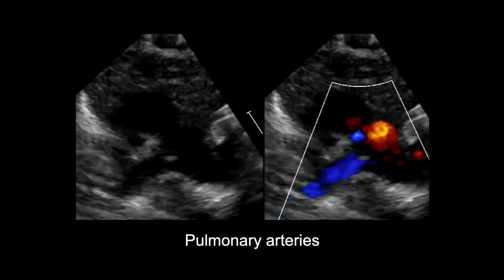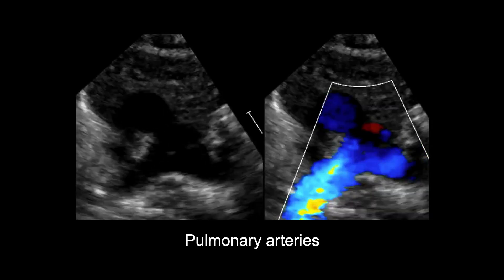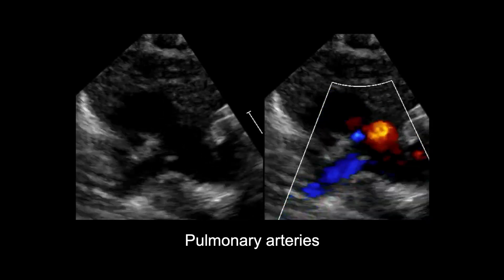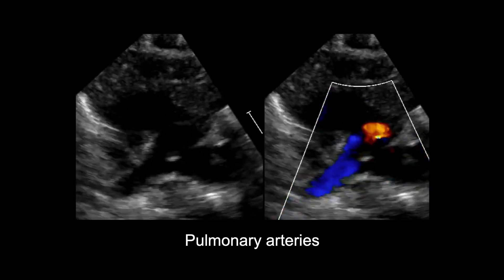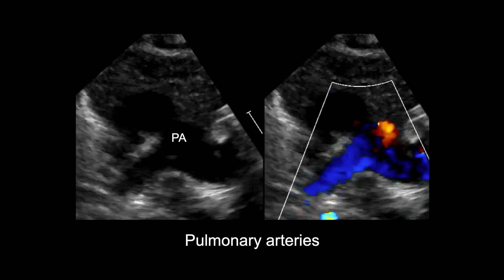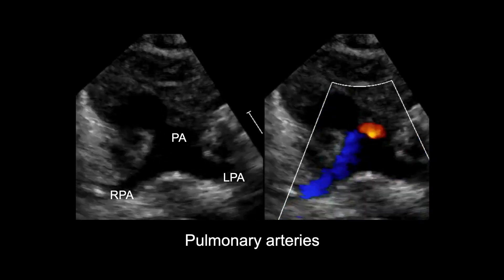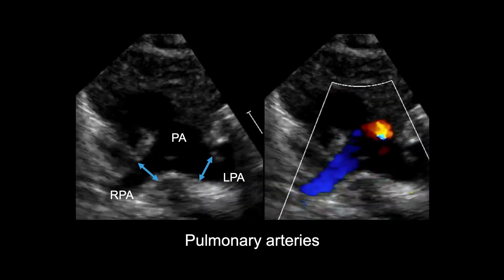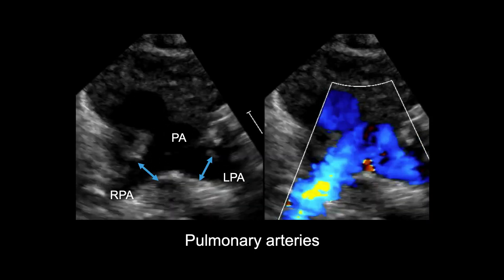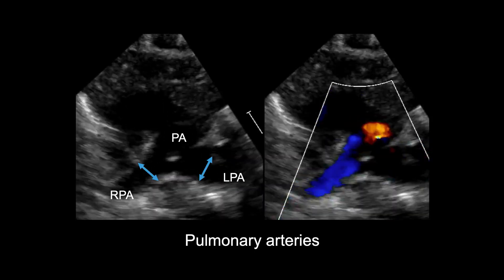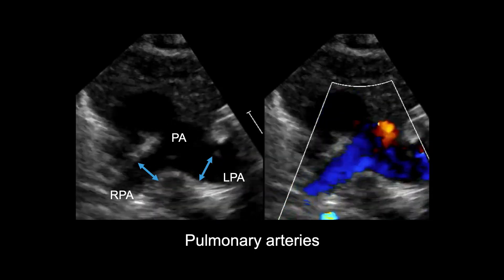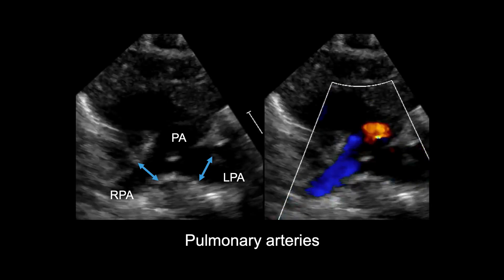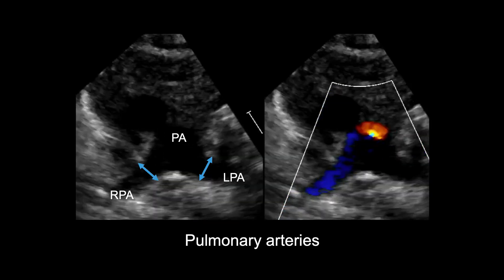Next, the size of the branch pulmonary arteries are assessed as they have a potential of becoming stretched or narrowed following the Lecomte procedure. The pulmonary artery and the right and left branch pulmonary arteries can be measured in their widest dimension. The branch pulmonary arteries in this example are good size with laminar flow, and flow from the PDA into the pulmonary artery can also be seen in this view.